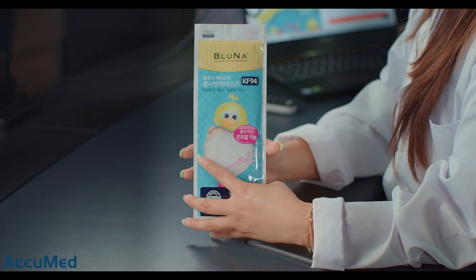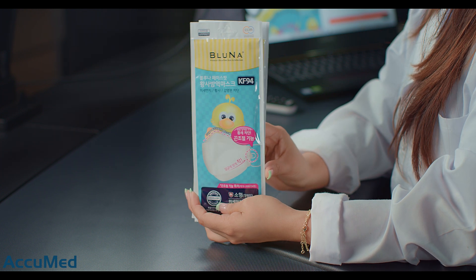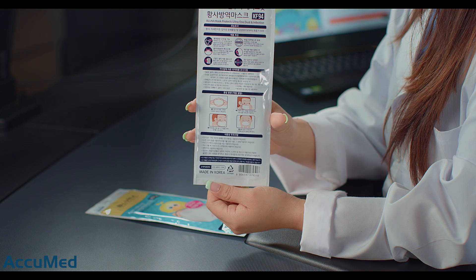Hello everyone and welcome back to the Acumen channel. Today we're going to be reviewing the kids Bluna KF94. These are the Korean standard KF94 and they do say that they are made in Korea. As we always mention, you should always verify if the reseller is authorized, so let's go ahead and look at the listing before we try these on.